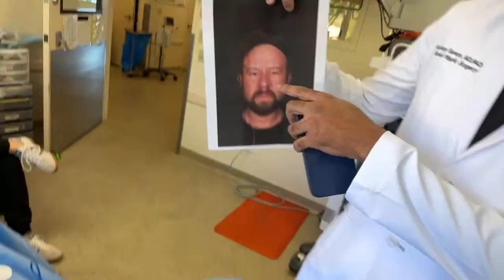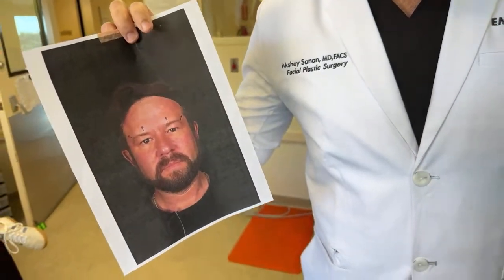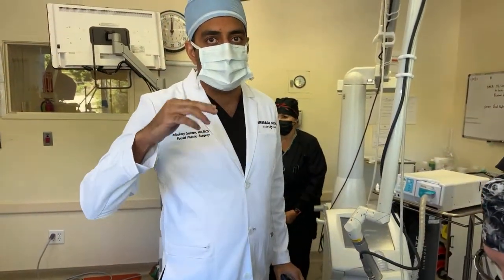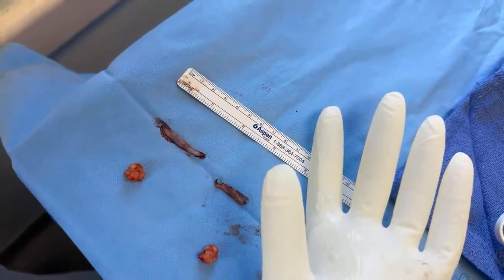And then he has extra eyelid skin, which we treated with an upper blepharoplasty, and he has some under eye fat bags, which I use the fat and I transpose it. What that means is I don't cut the fat out. I push the fat from the under eye down into the cheek, so it acts like a natural filler. All right, and I think we have the tissue. Let me show you guys over here. You guys can see the tissue from the eyelids and the fat bags that we did remove.